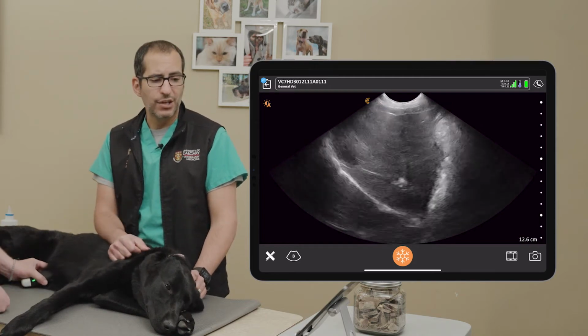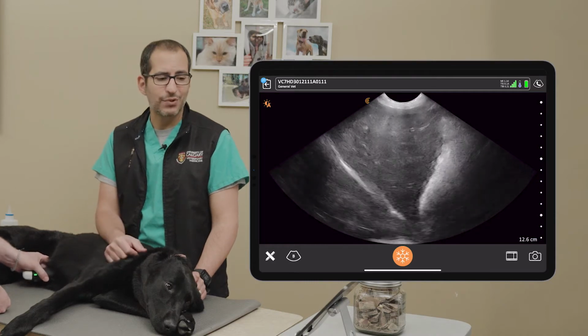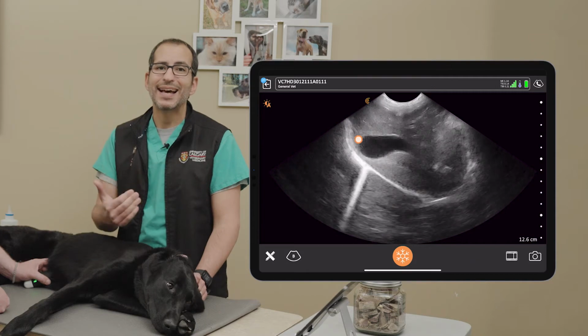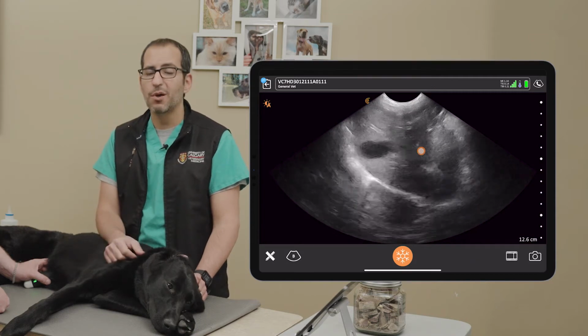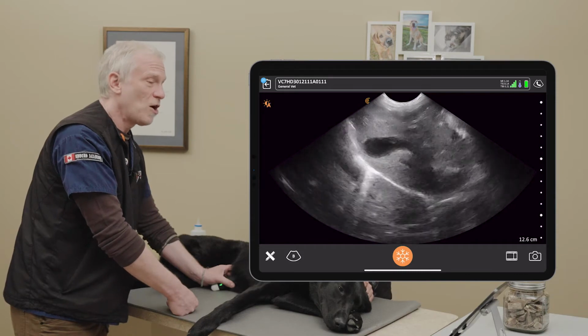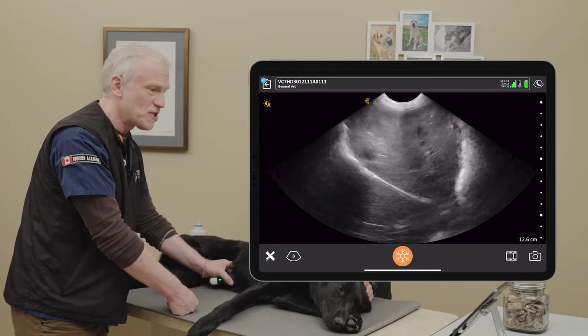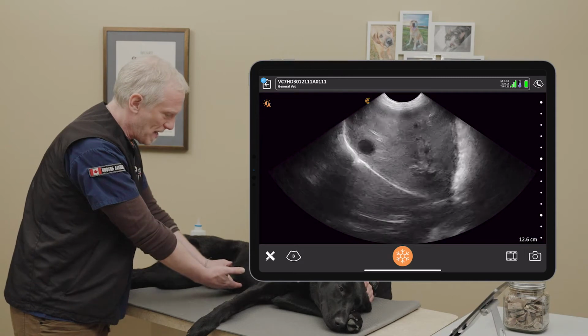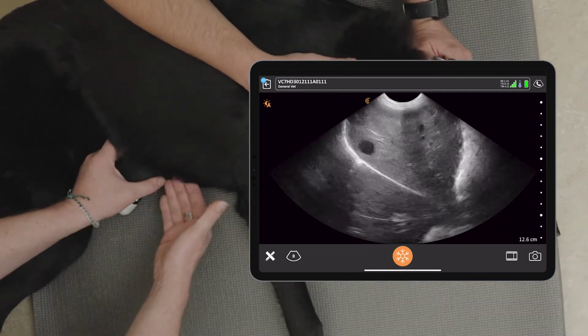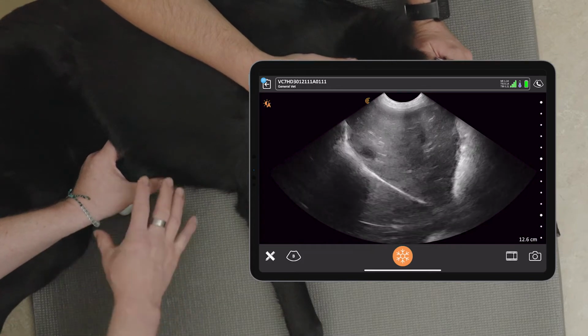So Dr. Boysen, I saw the gallbladder there, so why don't we go ahead and answer that question there. Is there a gallbladder wall halo sign, yes or no? So we're looking for the thin wall of the gallbladder, which is normal, versus that edematous looking gallbladder. Absolutely, and when we look for that gallbladder, it's just to the right of midline, so you can see that when I've got my probe here straight in on midline at about a 45-degree angle is how we want to look for that gallbladder and assess this subxiphoid site initially for fluid and assess the gallbladder wall.